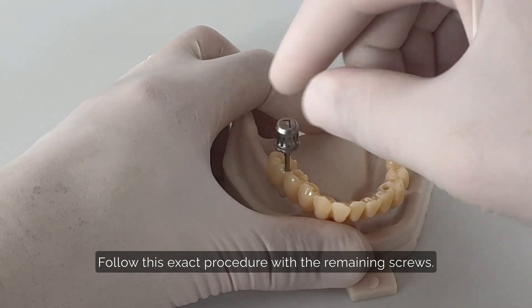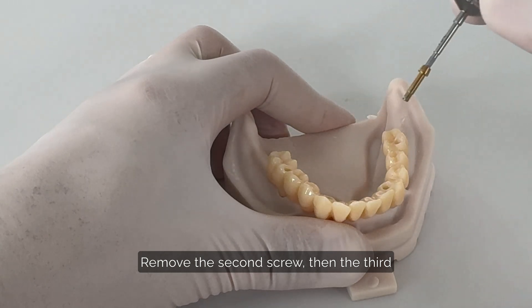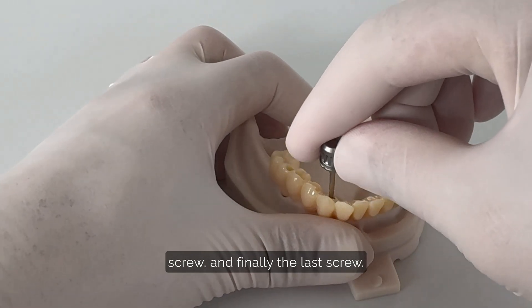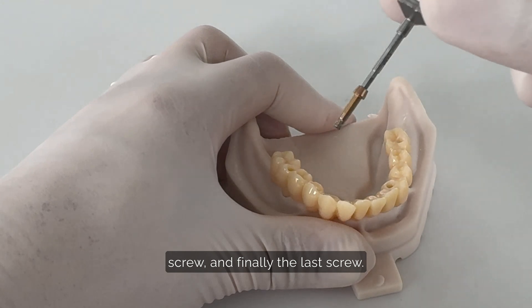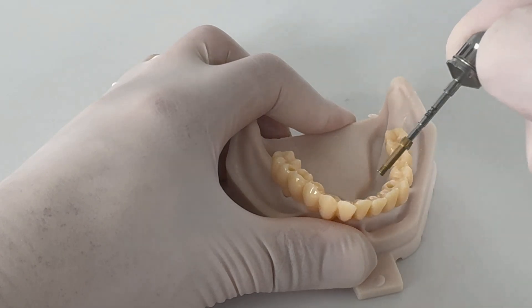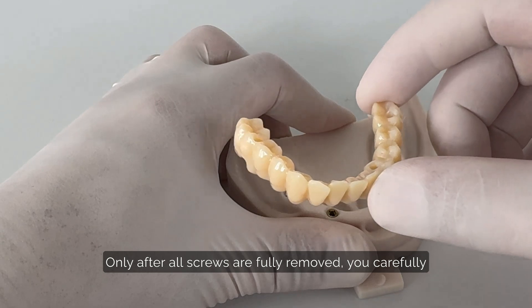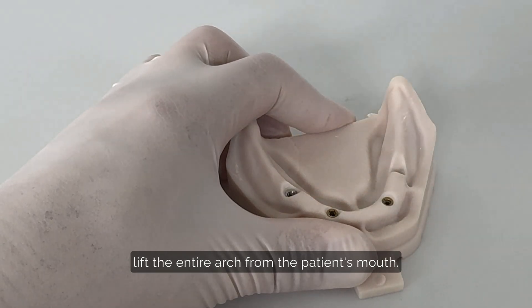Follow this exact procedure with the remaining screws: remove the second screw, then the third screw, and finally the last screw. Only after all screws are fully removed, carefully lift the entire arch from the patient's mouth.